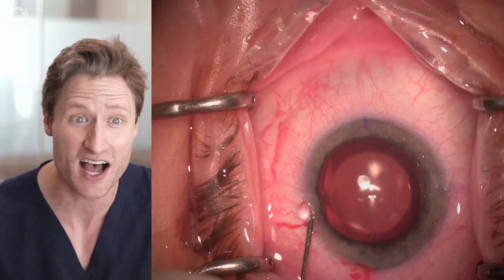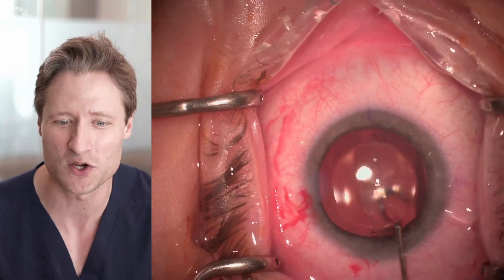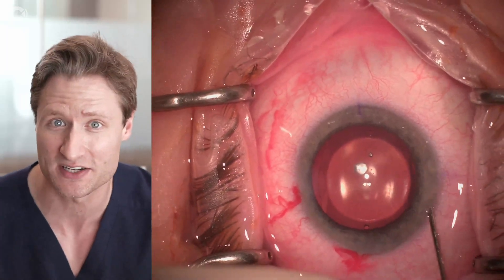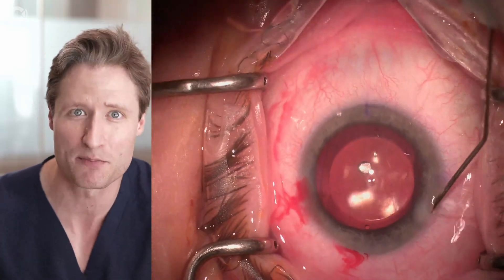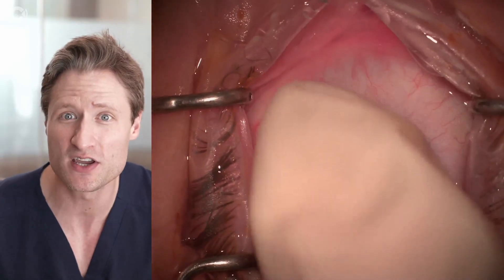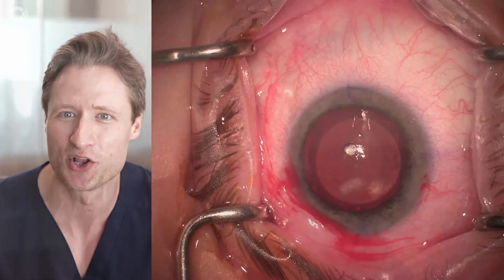You get a nice deep stable anterior chamber without needing any viscoelastic, which saves costs since you're not paying for viscoelastic, saves time since you're not washing it out at the end of the operation, and reduces the chances of a post-operative pressure spike if any viscoelastic is left behind. For years now we've been using a completely viscoelastic-free strategy — we don't even load the lens with viscoelastic — and switching to that has made these operations much better for us.